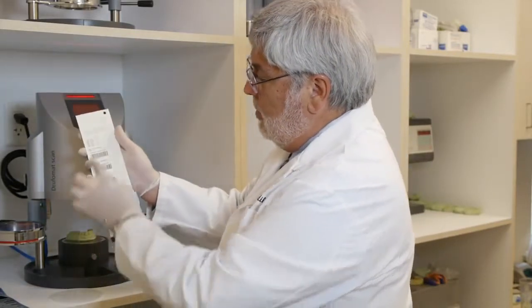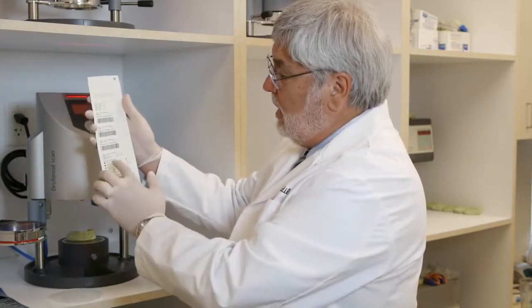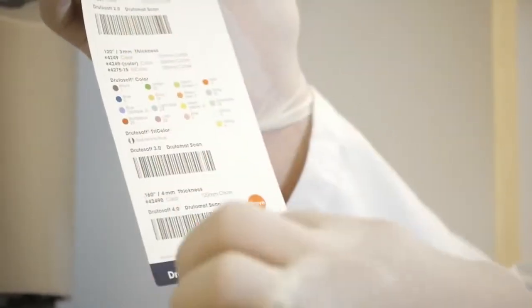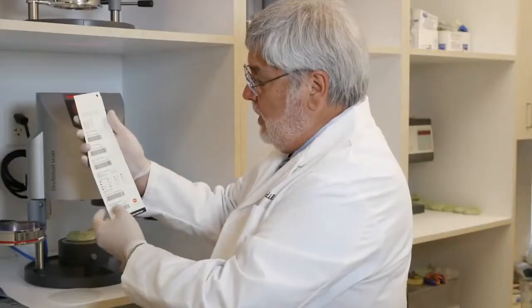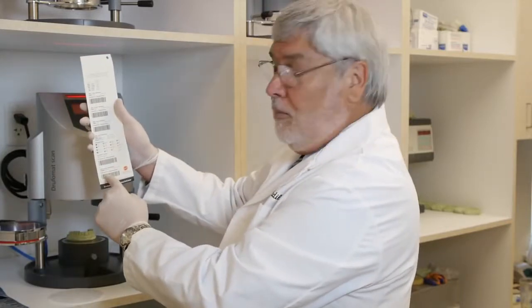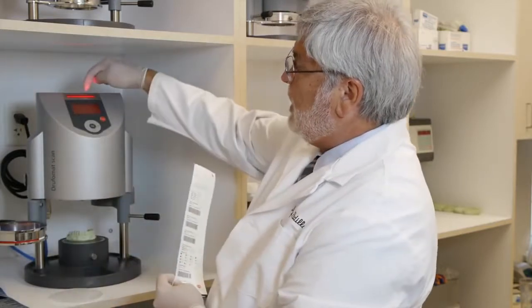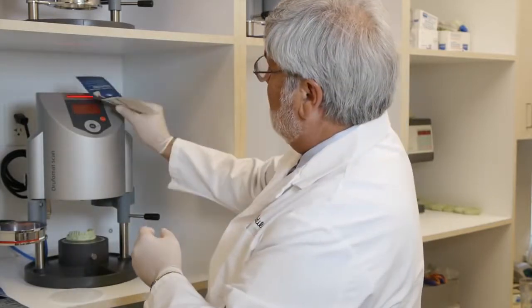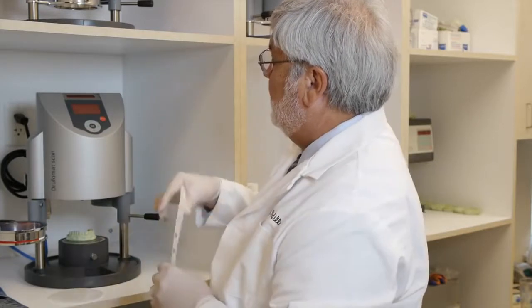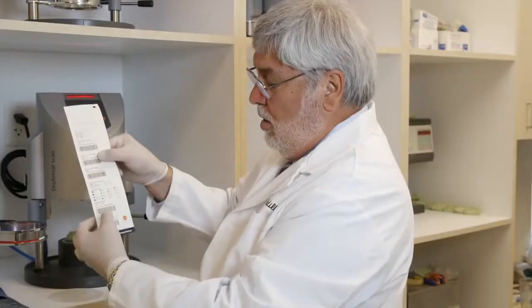On the back, you have several barcodes depending on the thickness of the material, the color of the material, and whether or not it's the first or second layer. So we're using 3.0 color material. So this is what we want to scan, this barcode right here. Here's our scanning light. Now, to double check it, on the screen, it will say Drufosoft 3.0, which is exactly what this is.